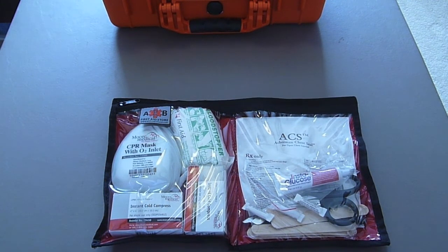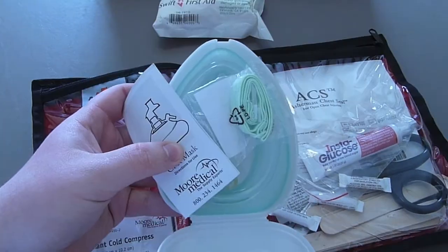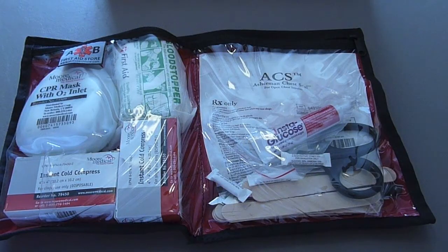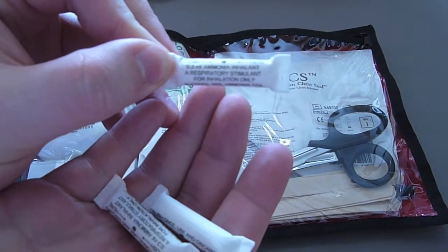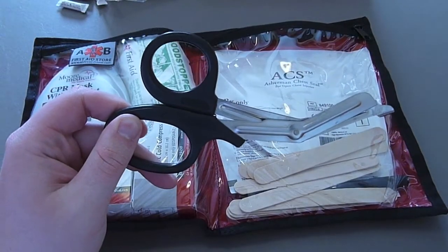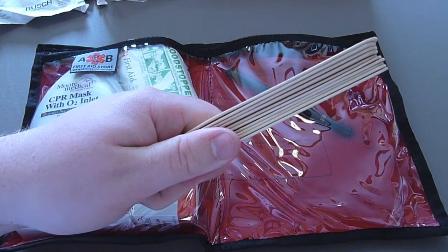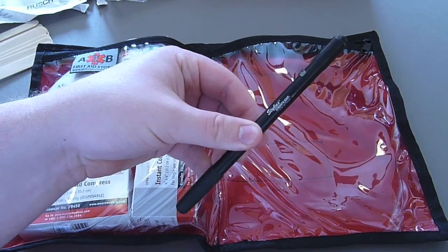So without further ado let's take a look at the items inside. Inside you'll find a blood stopper gauze, a CPR mask, two instant cold compresses. On the other side we have a pack of instaglucose, three ammonia inhalants, a general pair of EMS shears, an Asherman chest seal, a bunch of tongue depressors which can also be used as splints. The last item is a Streamlight Stylus.